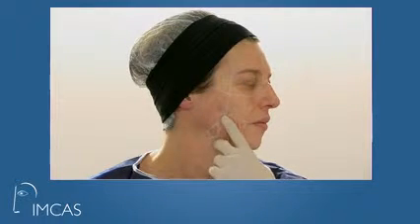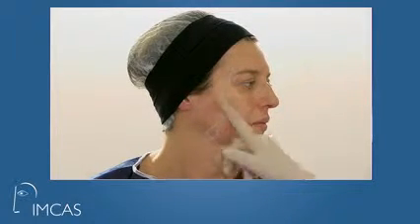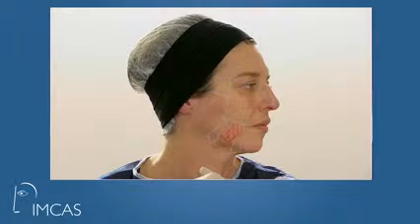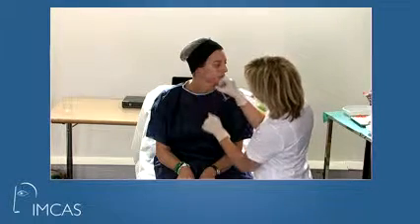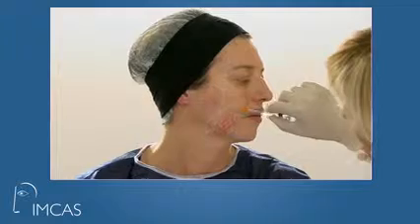So I will use one cannula, of course. I will use the 25 gauge, 6 centimeter cannula. Why? Because the length of the cannula is enough, and 6 centimeter is very interesting to go upper, and to be very large in our injection.